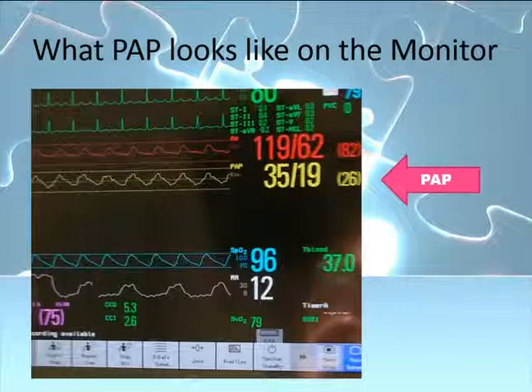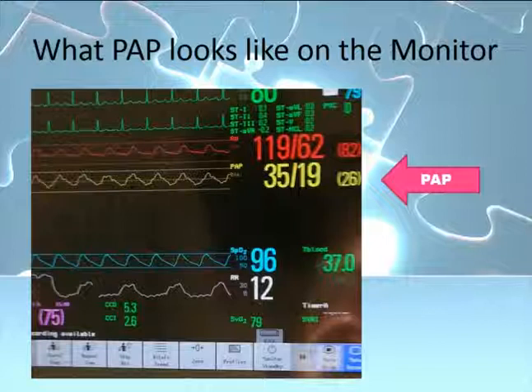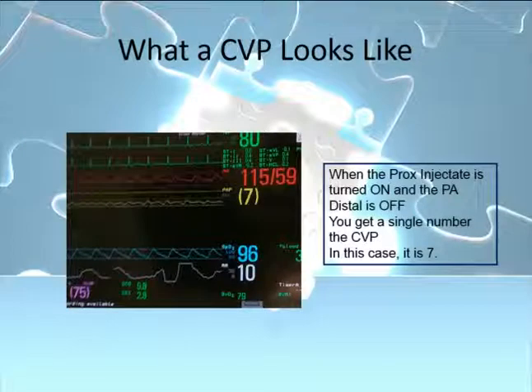Then on your monitor, this is what the pulmonary artery pressures look like. This patient's 35/19, may have just a little bit of pulmonary hypertension, but this is expected in open heart patients. And this is what your CVP would look like. When the proximal injectate is turned on and the PA is turned off, you will get a single number, the CVP, in this case it's 7.